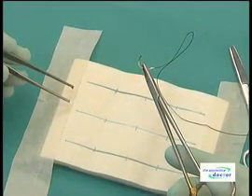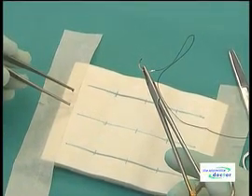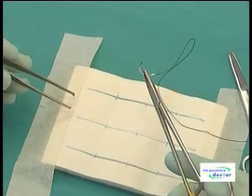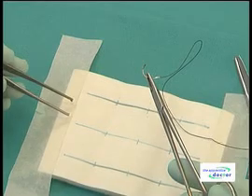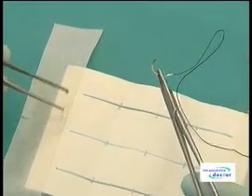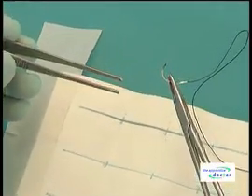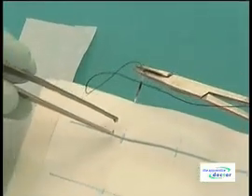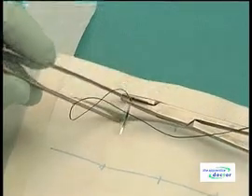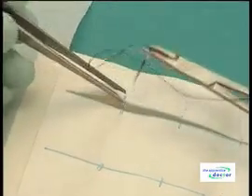Use a needle with suture material attached, clipped to a needle holder, and the prepared imitation skin. Take the tissue forceps in your left hand and the needle holder in your right hand. Ensure that the needle tip is facing downwards and towards you. Use the tissue forceps to lift up the skin on the far side of the incision.